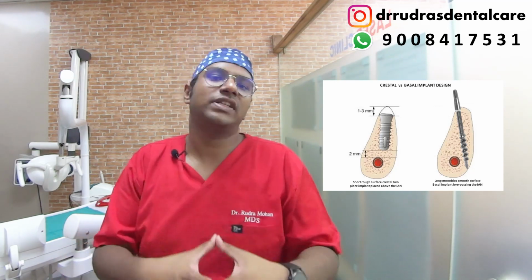Now primary stability in layman terms is very simple. It is how an implant initially anchors to the bone and how stable it is and how it is not able to move about. Now implant failure generally is considered when your implant starts moving, right? Or if there is infection around the implant, such as peri-implantitis or peri-implant mucositis. Now when it comes to basal implants, the anchorage is so good because it is anchoring in the basal bone or the cortical bone, which is free of any sort of defects per se because of any pathologies.